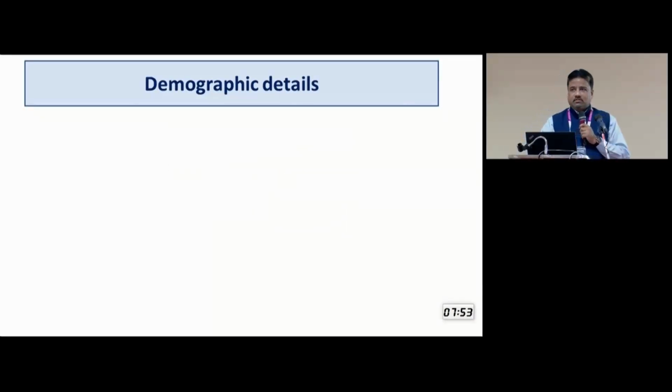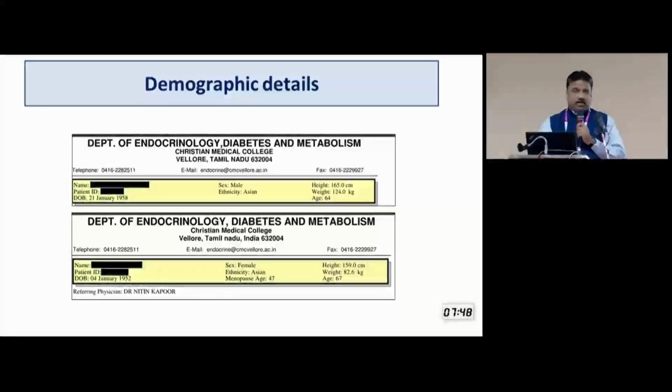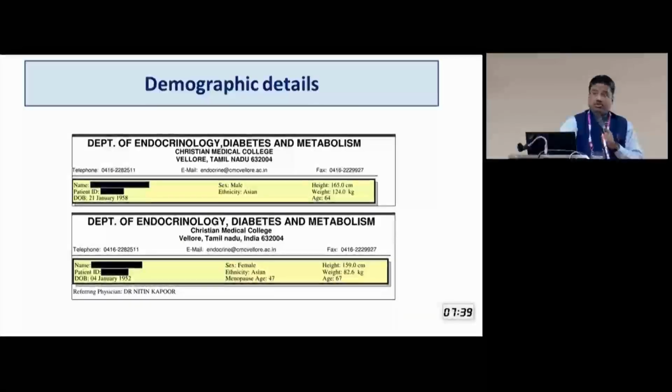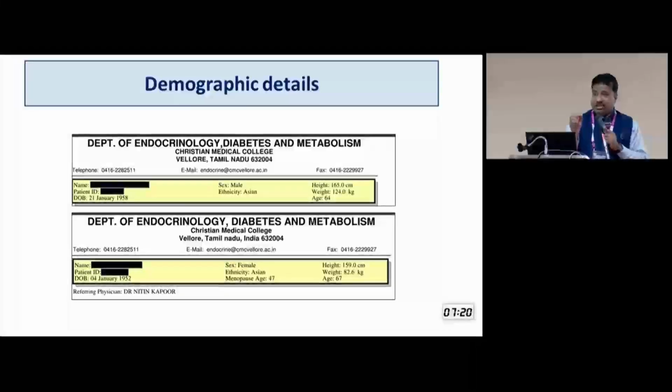Now it looks simple. It will have the name, age, and gender of the patient. But as a clinician, if I have to look at one important thing in terms of the demographics mentioned on the report, that is the age of the patient. I should make sure that the actual age of the patient is mentioned here. It's not the Aadhaar card age, it's not the empirical age that the patient is given, or the hospital record age, because later on, when we see the different parameters and percentiles that are calculated, they are calculated by the age which is entered here.